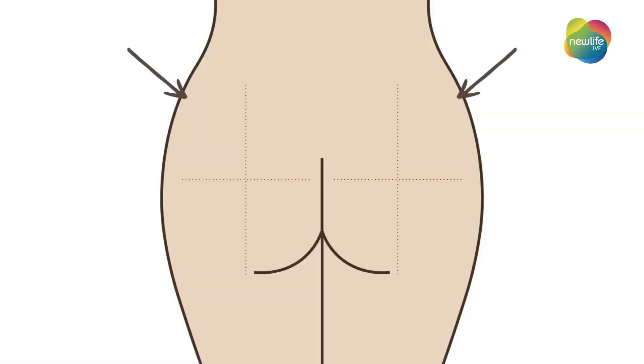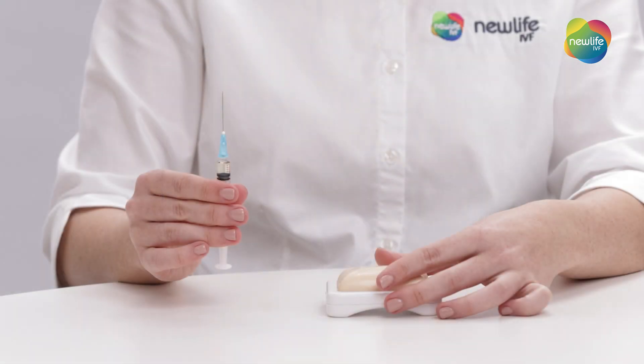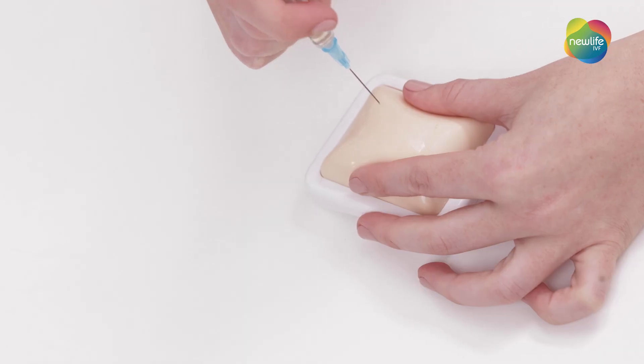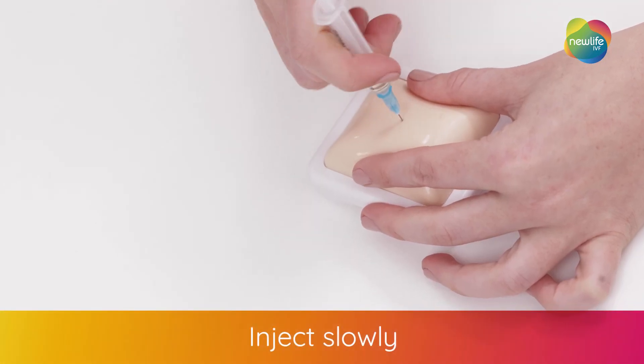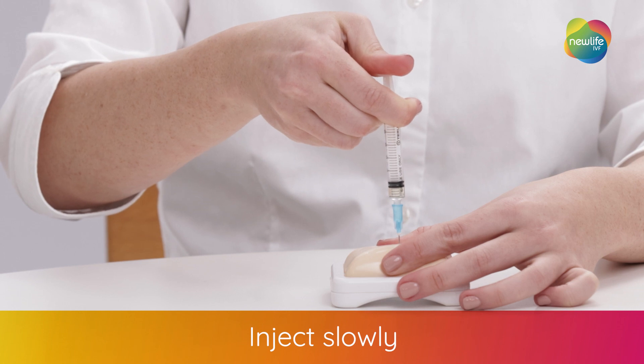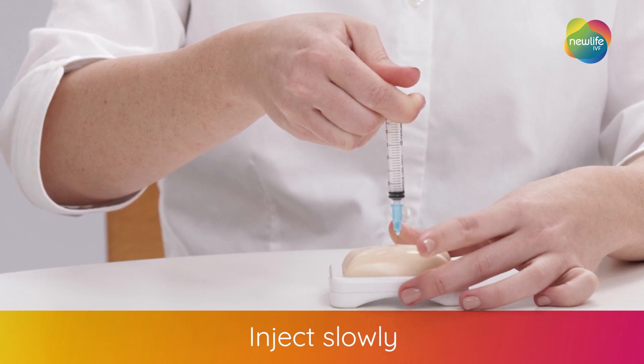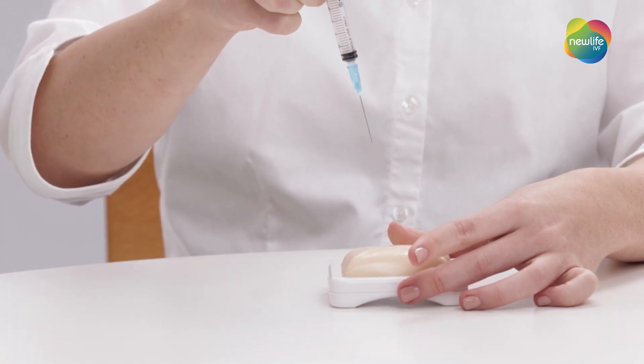The injection is administered into the upper outer quadrant of your buttocks. Due to the specific location the medication needs to be administered into, you may need help from a GP or health professional. Hold your syringe at a 90 degree angle. Insert the needle into your skin and push the end of the syringe until the dose has been delivered. Release your pinch and remove the needle from your skin. You've now finished injecting the progesterone in oil.